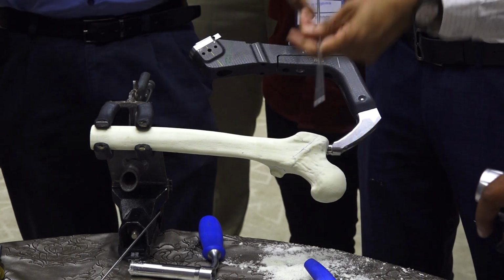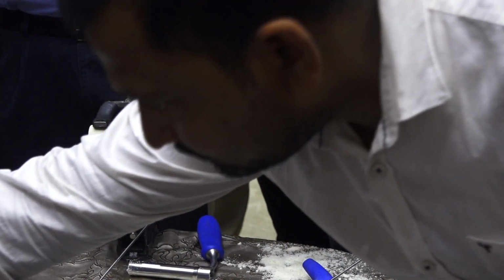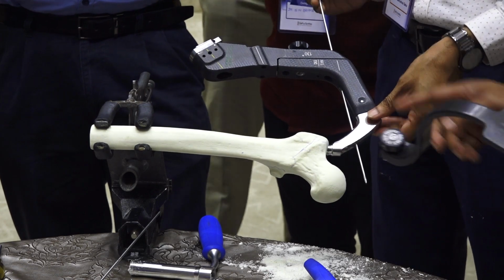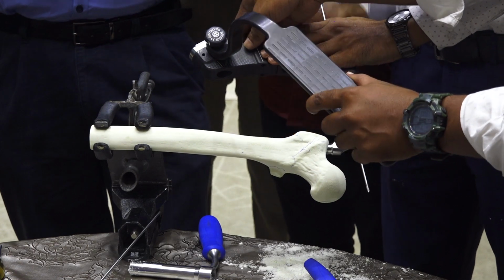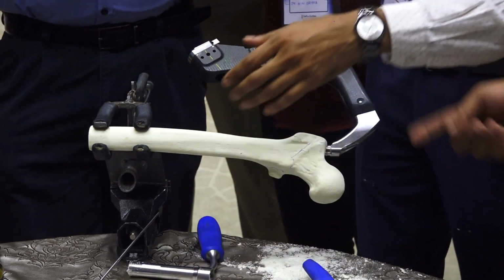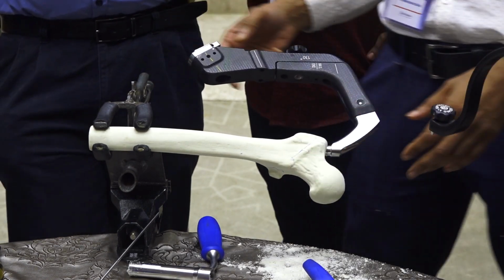Whether you can see the trajectory of the blade through. If your jig is like this, or like this, or like this, your screw will go posteriorly or anteriorly. So before entering here, you can put this guide pin through this area, and then check under C-arm in the true lateral view. This line and this line should match, and this should go in the center. Then your position is perfect. You don't need to manipulate and can directly put the guide wire. Or else what we usually do, we put the guide wire and then we withdraw it and manipulate it a little bit and try to go in the center.